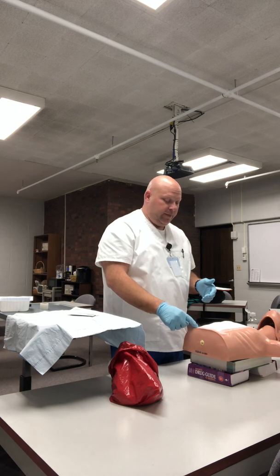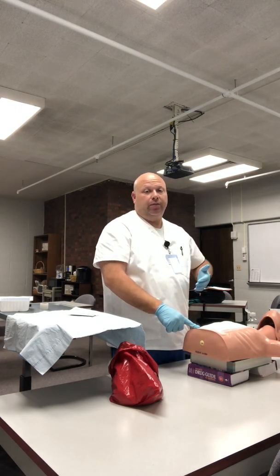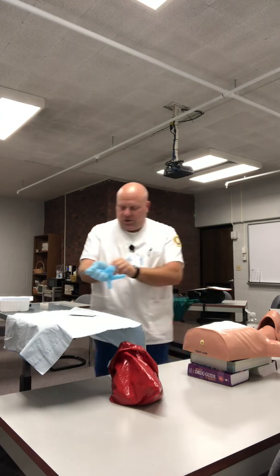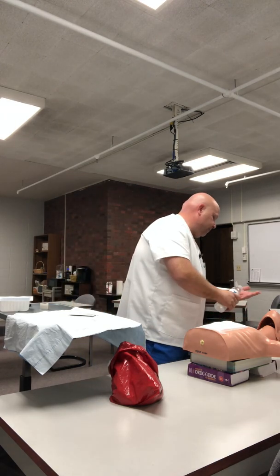At this time, I would record my name, date, and the time on the corner of the tape of the bandage. And also I would note how many sutures and how many staples may be in this wound. I would remove my gloves. I'm going to perform hand hygiene again.